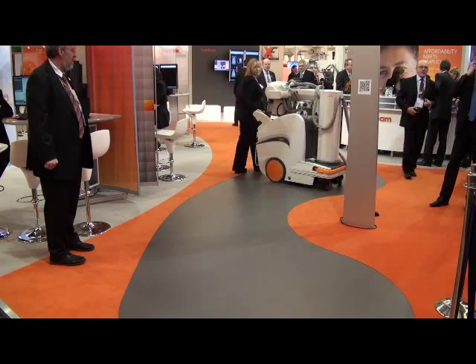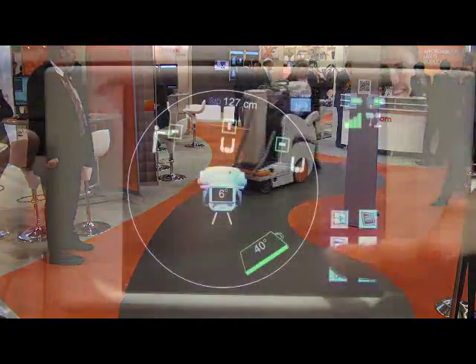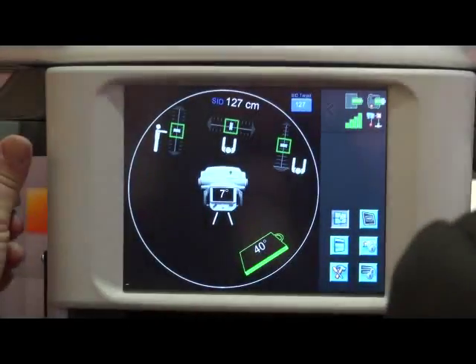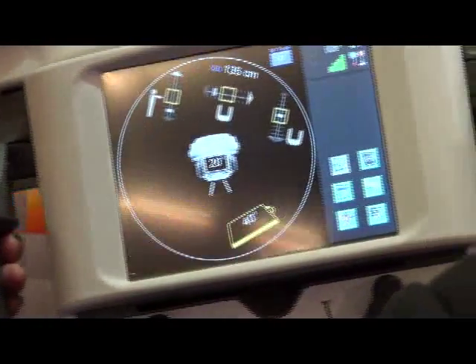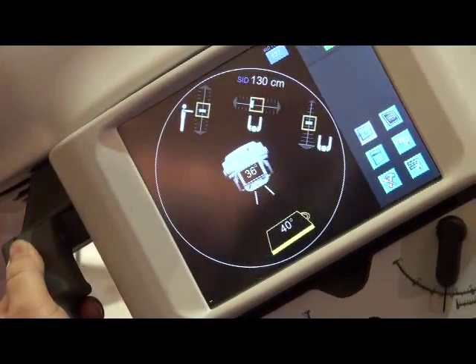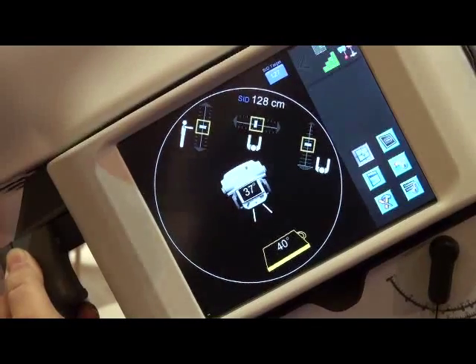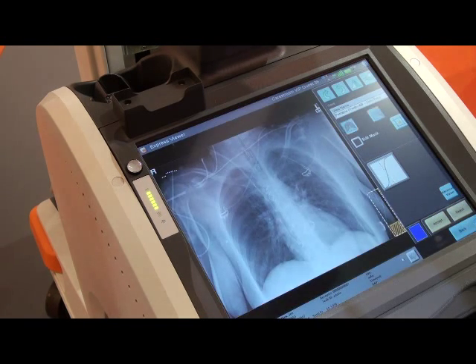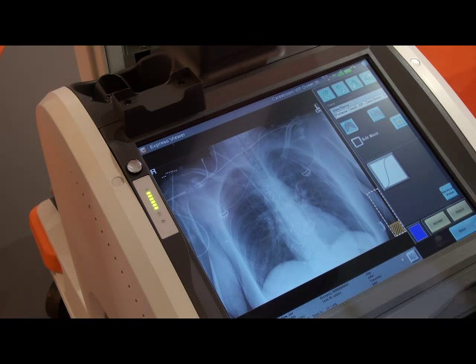Also unique to the product is the tube and grid alignment software. This will improve the image quality and ultimately benefits the patient — we're actually taking the best image quality with the sickest of patients, because this machine is going to be used in A&E departments and ITU departments where we've got really sick patients and it's critical that they get good quality images.